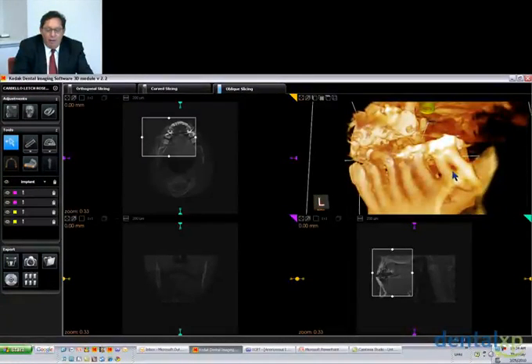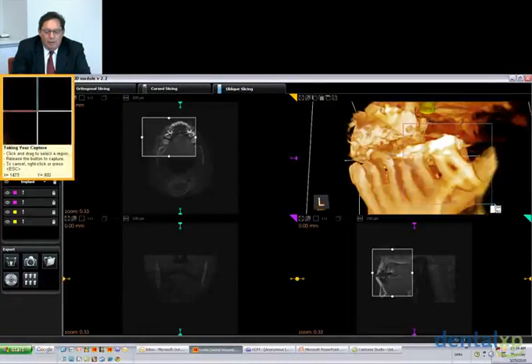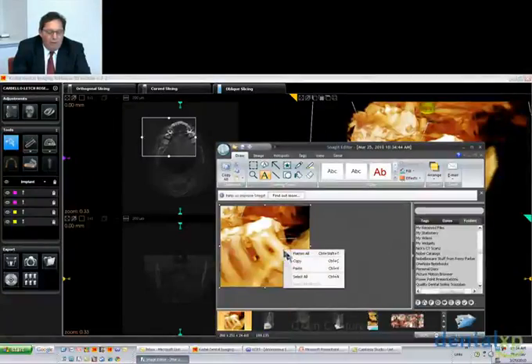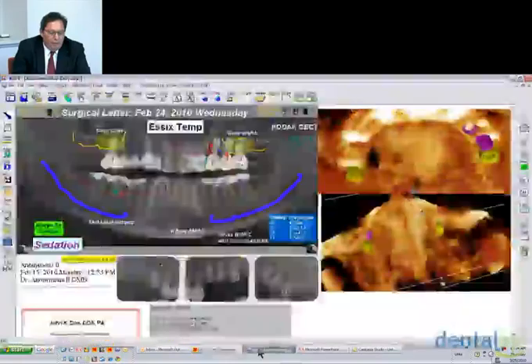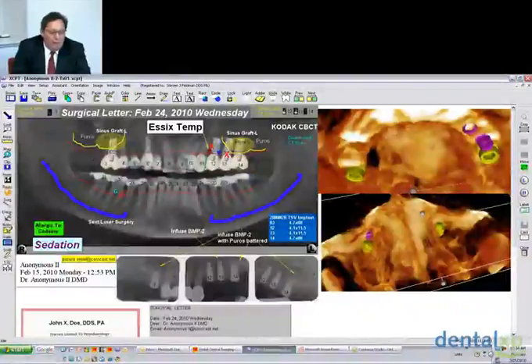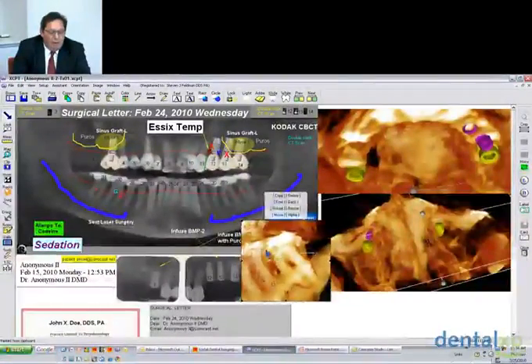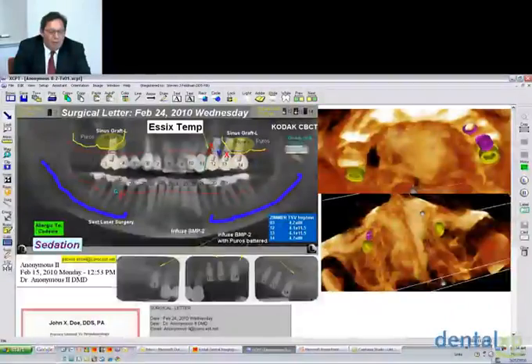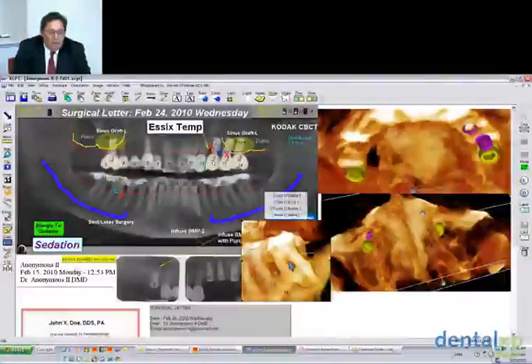And if I wanted to capture that and document that, I would just use our capture tool and accept, document the furcation, copy it, and simply paste it into our document, perhaps right down here. Just paste it, and maybe double click on it, place it here, and then open it up, and there it is, documenting it.